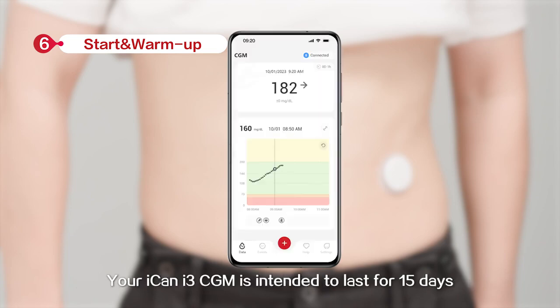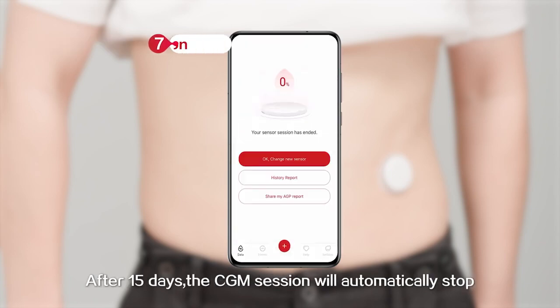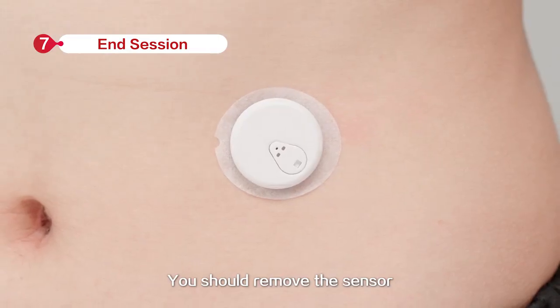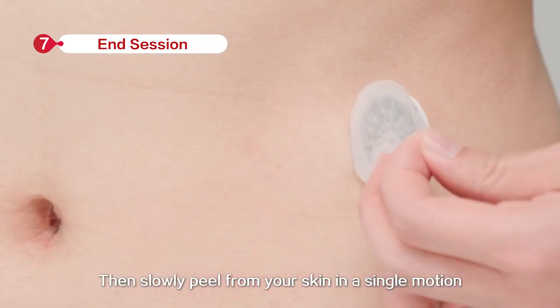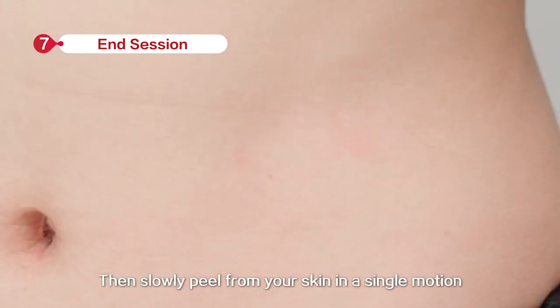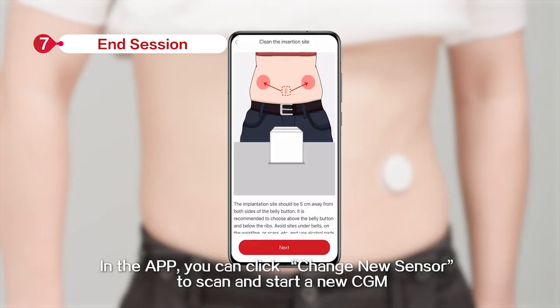Your ICANN i3 CGM is intended to last for 15 days. After 15 days, the CGM session will automatically stop. You should remove the sensor by pulling up the adhesive edge, then slowly peel from your skin in a single motion.